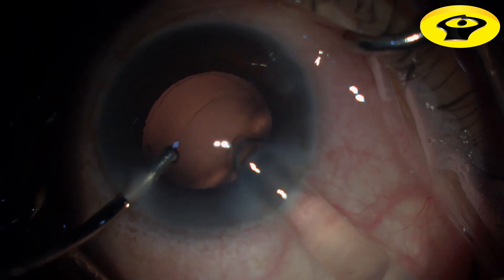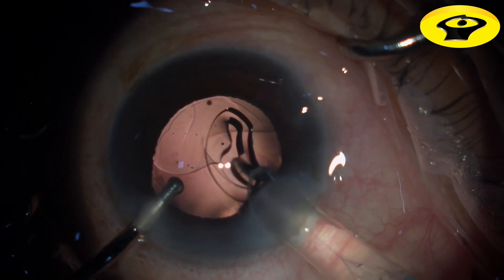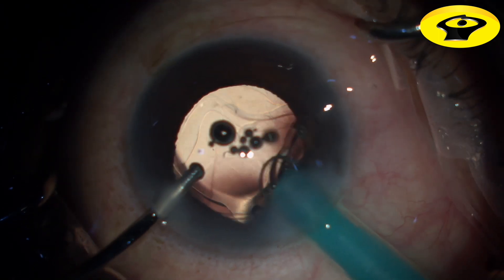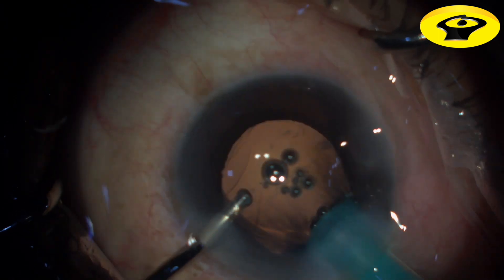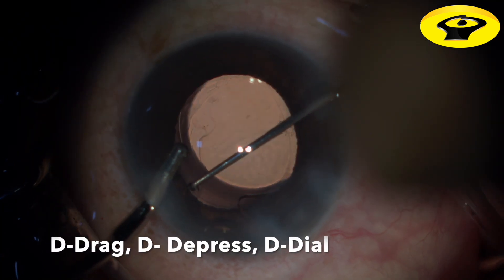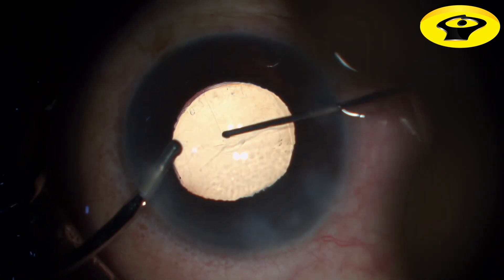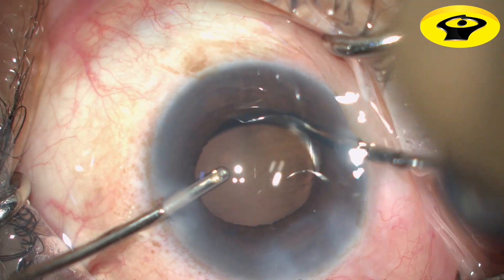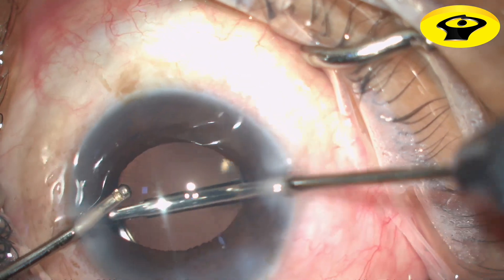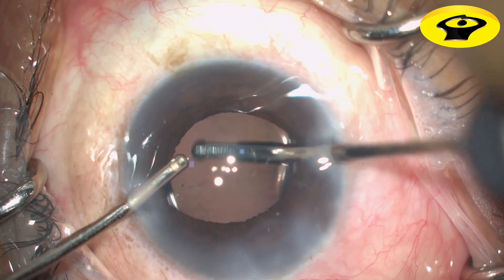Foldable intraocular lens placement is done with irrigation on one side. The leading haptic is made sure to go under the capsular margin; the trailing haptic is kept over the iris with constant irrigation flow. I follow three Ds: drag the lens, depress it, and dial it into the bag. Dragging ensures the optic-haptic junction comes away from the capsular margin; depressing ensures it goes under the margin; then dialing the lens puts it into the bag.